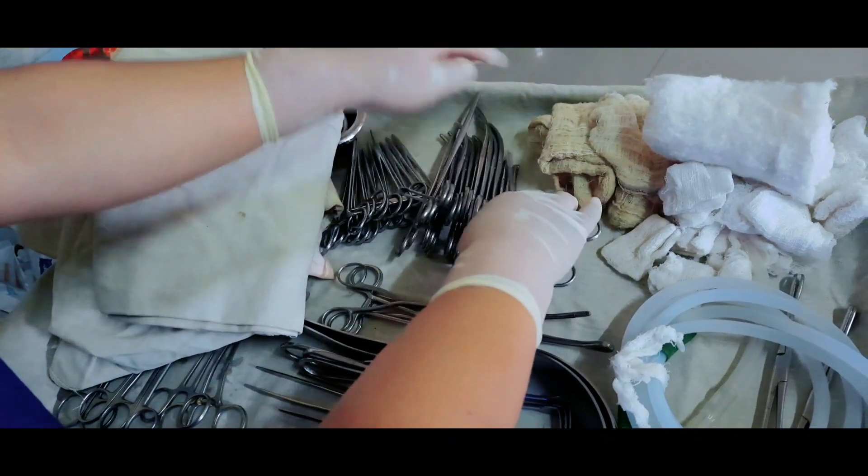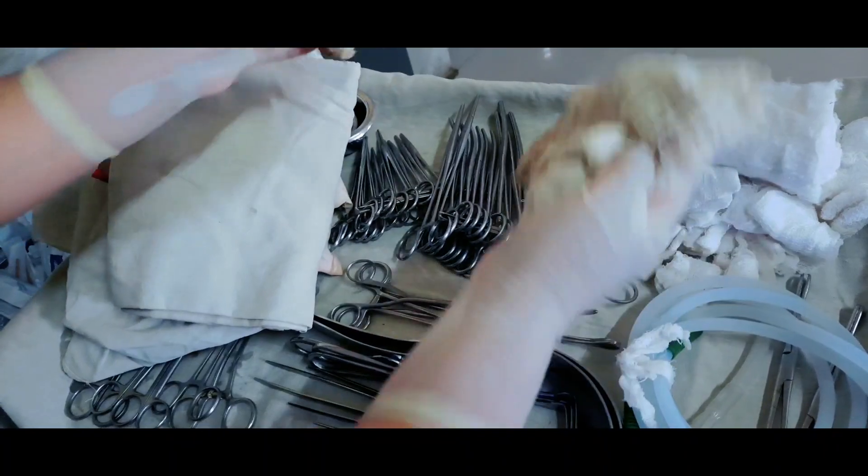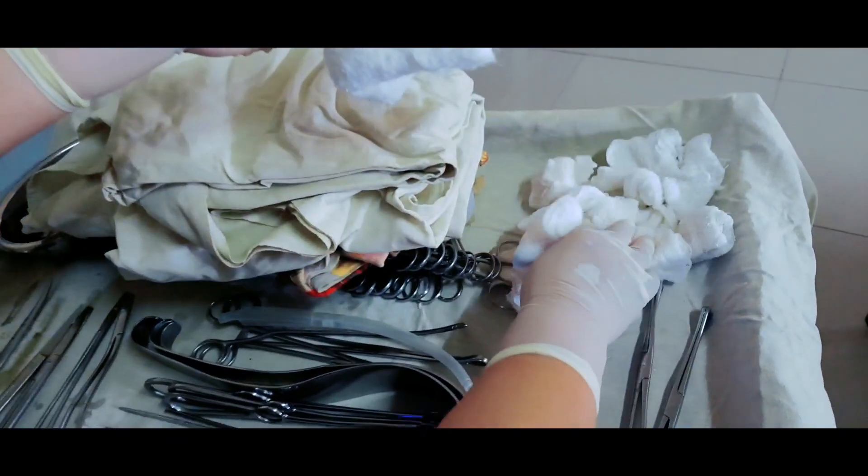Different size Kocher forceps — 2 in number. And two mobs. Cotton pad and gauze pieces for dressing after the operation. After complete preparation of the trolley, the trolley has to be completely covered and kept ready.